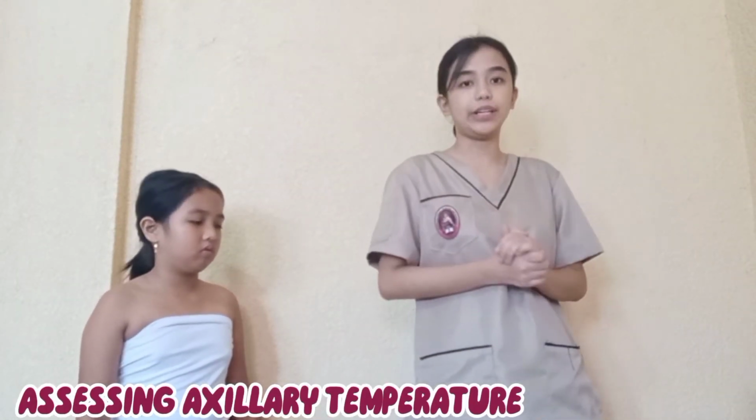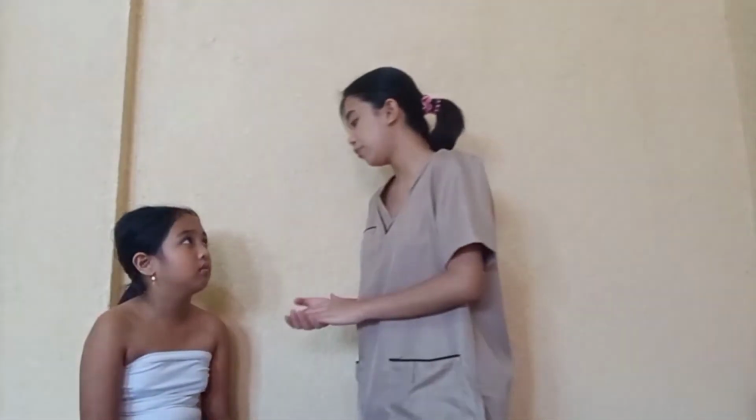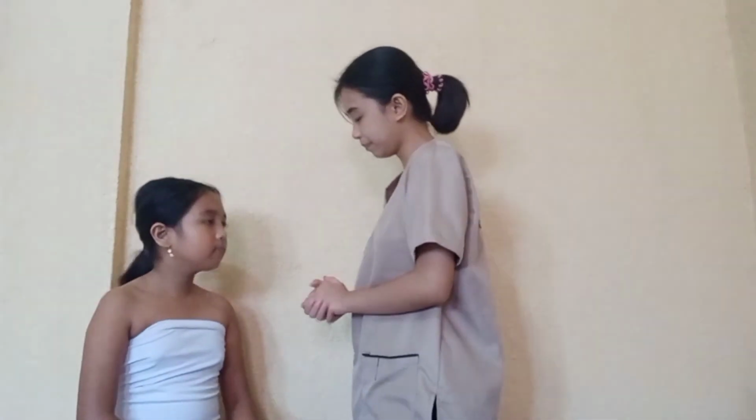So the next thing that I'm going to do is to assess the axillary temperature. So I'm going to move the patient's clothing to expose only the axilla. So ma'am, I'm going to move your clothing. Is that okay for you, ma'am?